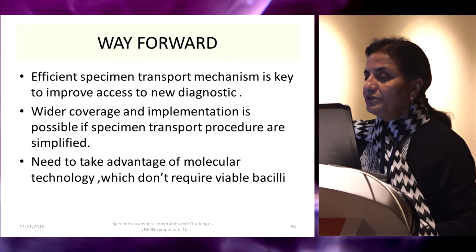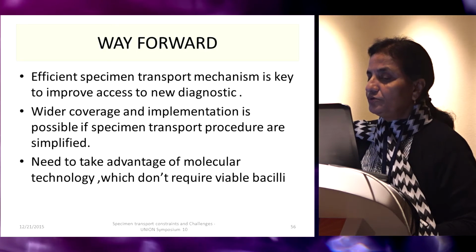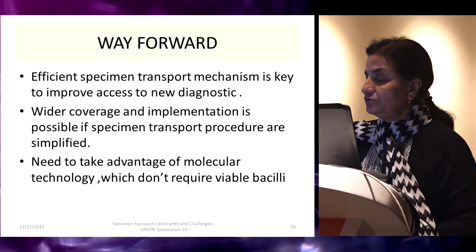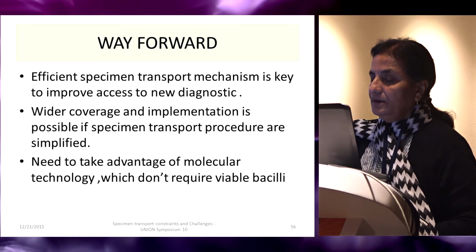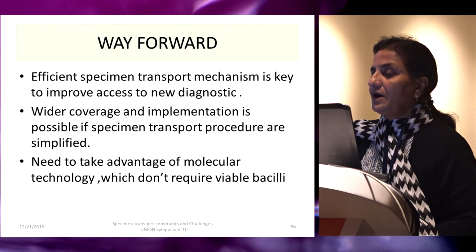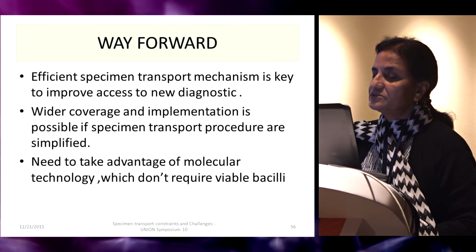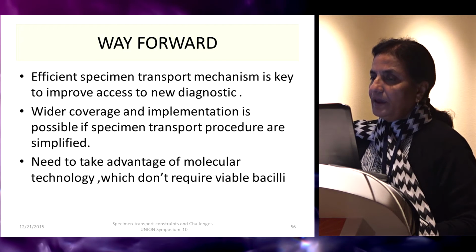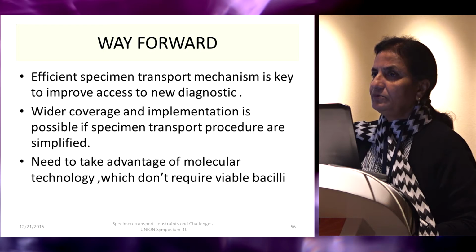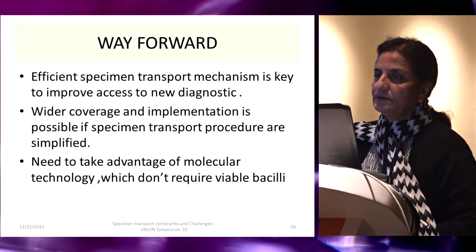molecular. For the group of patients who need Xpert testing, we also need to reduce the transport time and simplify the specimen transport. We need to eliminate the cold chain, and we need to make specimen transport more biosafe so that we are able to ship them. We can also use other postal services by making the specimen non-infective. And we also need to simplify the shipment needs, which at the moment, sending it in a transport box and then getting these transport boxes back is very tedious.